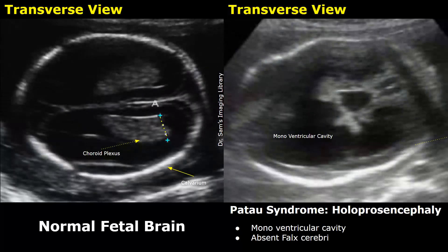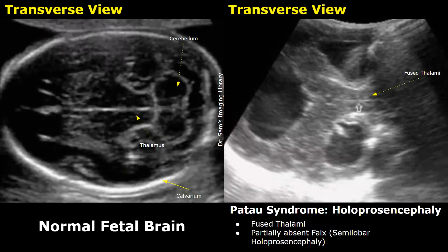This is another image showing a monoventricular cavity with absent falx cerebri. Only a small, abnormally formed brain tissue is present. This appearance indicates alobar holoprosencephaly. This other image is of semilobar holoprosencephaly. There is partial separation of the ventricles. You can see some brain tissue, but anteriorly you will find fused thalami. The falx cerebri is partially absent — only a small part of the falx cerebri is present between the thalami.